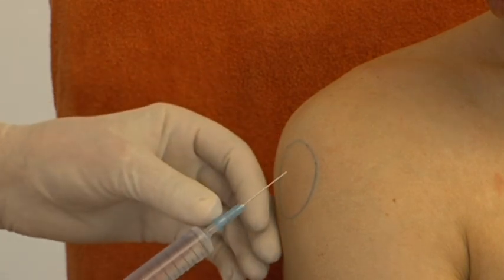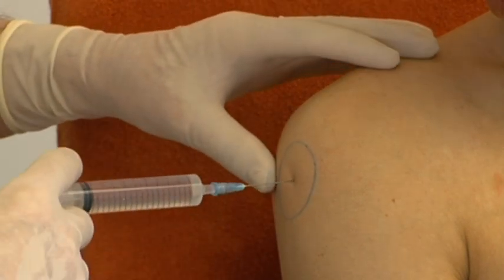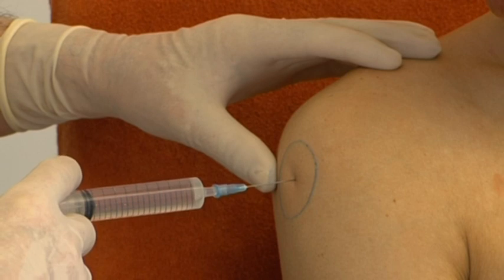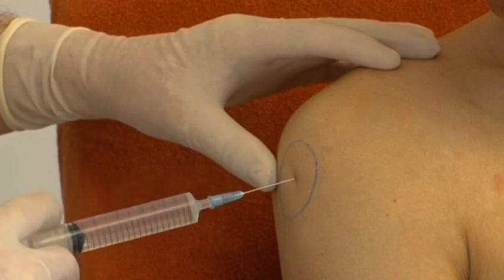At its center, the needle is inserted until it hits bone and then slightly withdrawn to a point where the first quantity of fluid is injected.